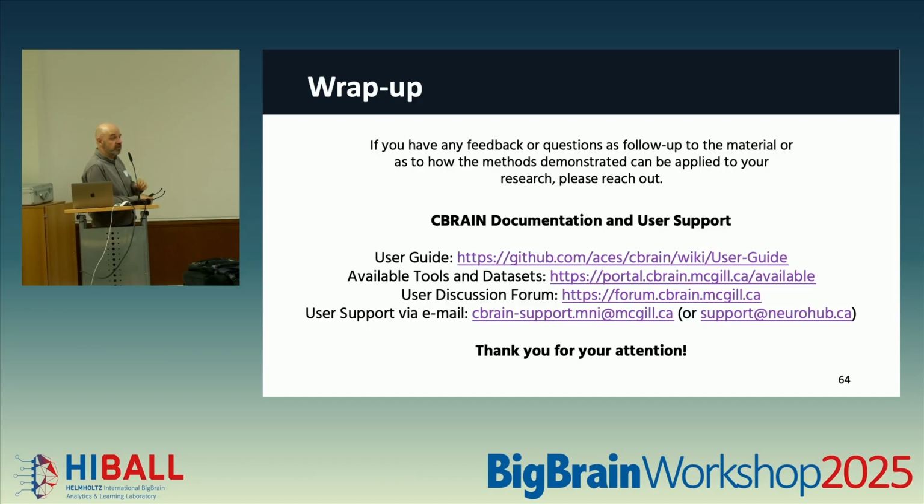This is off our wiki page that gives you examples about creating an account that you would use beyond the exercises that you've done today. We have step-by-step examples of running through various pipelines, screenshotted so you can see exactly what was done to run those pipelines. We have a public page, for which you don't need an account, that gives a full listing of all the scientific tools and data sets that are available through the environment.